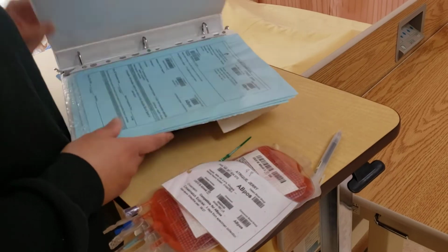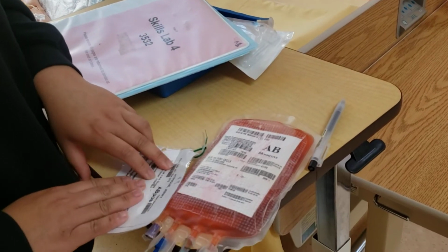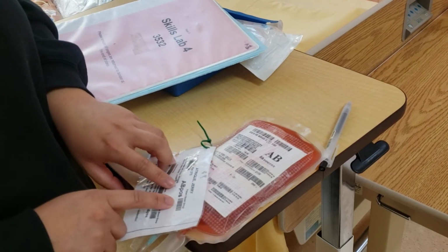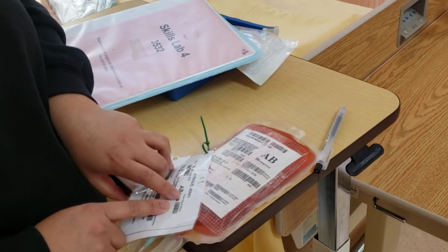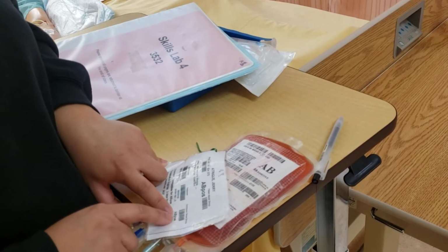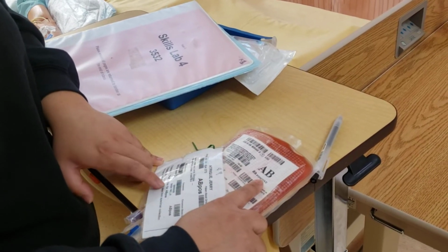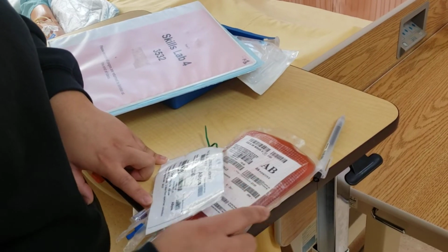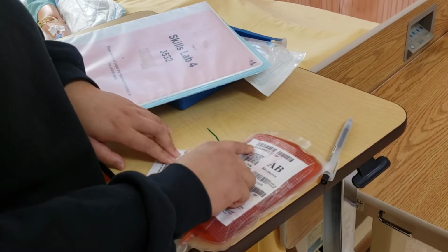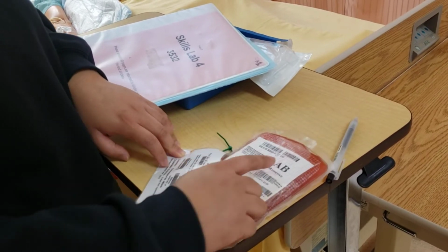And the next check that we'll do for our third check, we're gonna check the blood tag against the blood bag. So I'm gonna check my blood tag, and the second nurse would check the blood bag. The information that I'm looking for are the patient's blood group. So we're looking at the component blood group, making sure it's AB positive, and the type of the blood product that is ordered is red blood cells, and then the donation number is C051008900445, Y in a box.